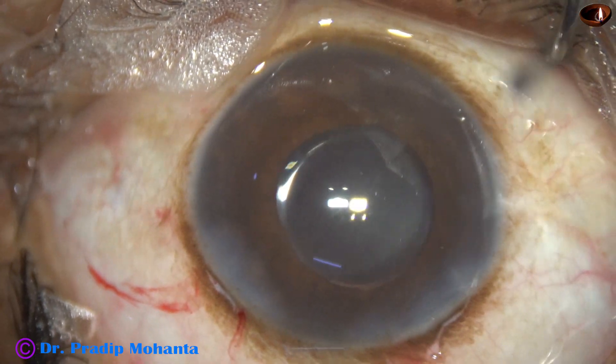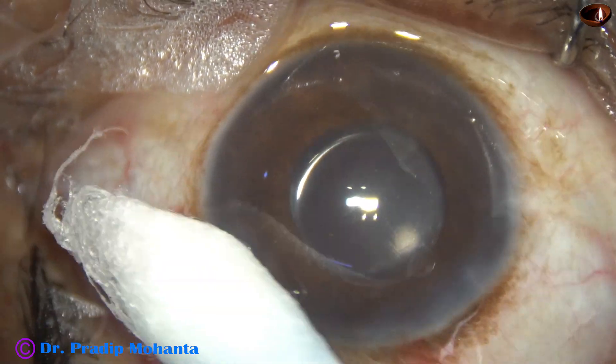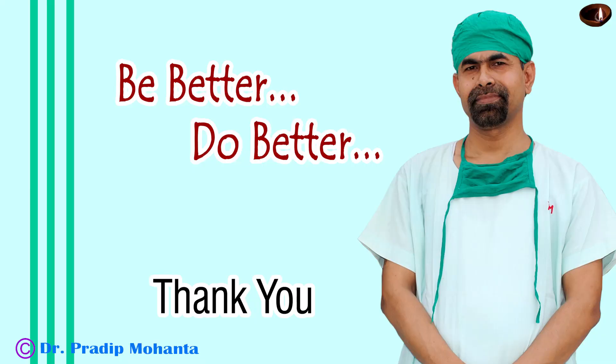There should be no leakage from any side. The intraocular pressure should be on the higher side and the eyeball should be firm. The case is now concluded. Thank you very much for your attention. I hope this video will help you in developing your surgical skills. Be a great surgeon and serve your patients with love, respect, empathy, and great surgical competence.